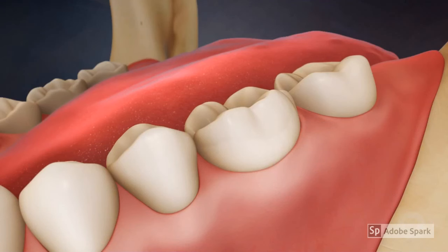A routine scaling and polishing is an excellent way to establish a healthy baseline of cleanliness in the mouth.